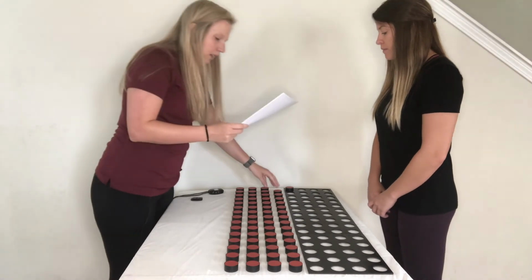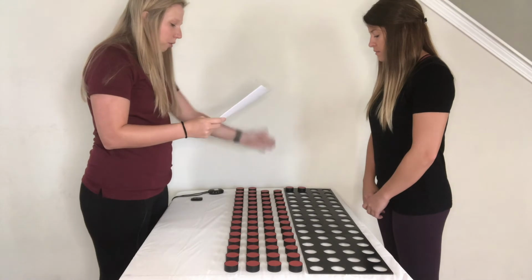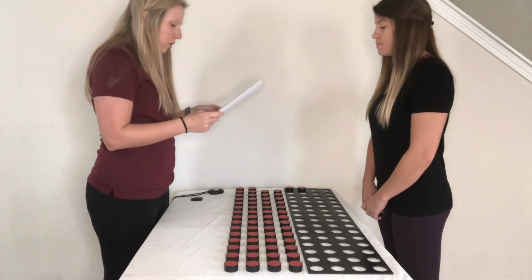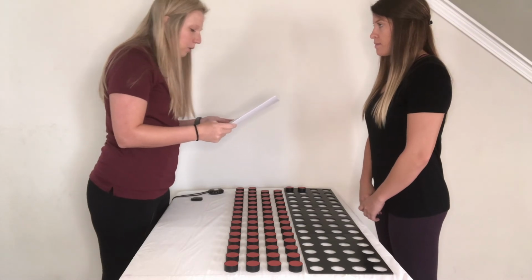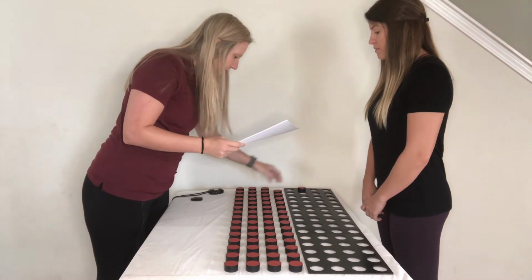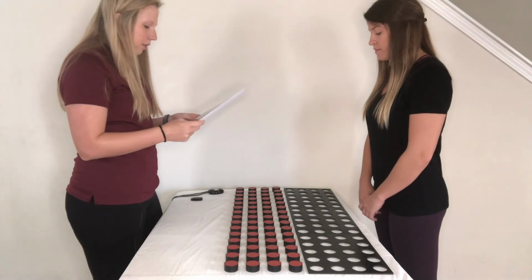Now you must pick up the next disc in the column on the right, and so on. You will move from right to left on this test. Once you complete one column, repeat the previous sequence in the second column until you have filled the entire board. You may hold the board with your free hand if you wish to do so.